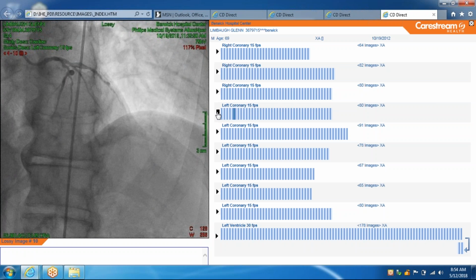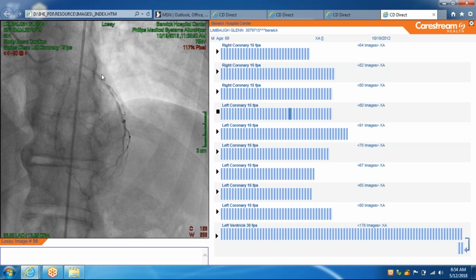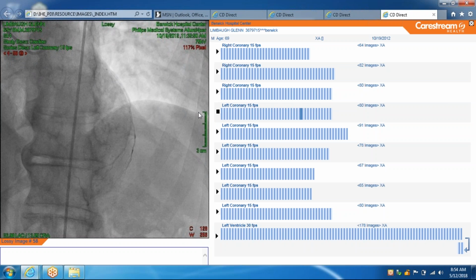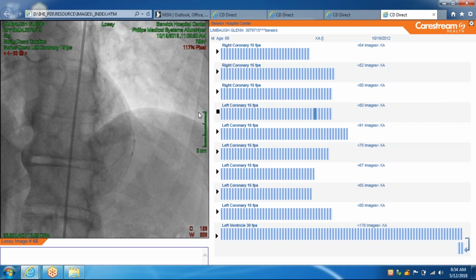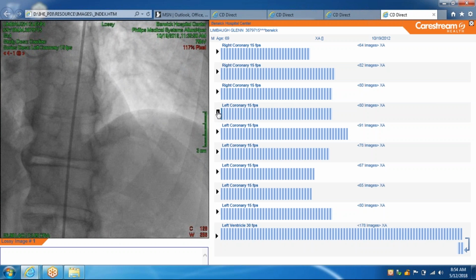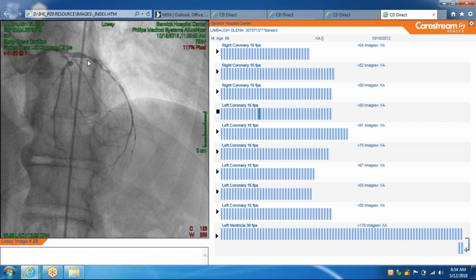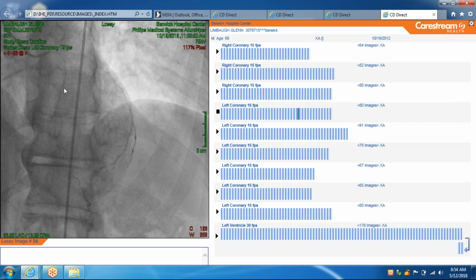All right, so if you look at the blood vessel, again, lumpy, bumpy, there are probably some blockages. You need to have a close look at the vessel, especially on the circumflex, it's lumpy, bumpy stuff. This is the LAD that comes here.